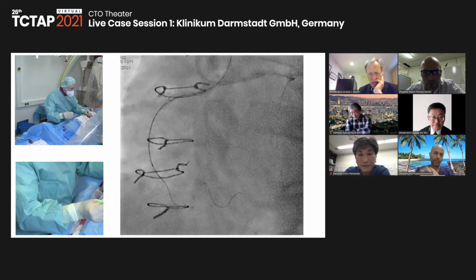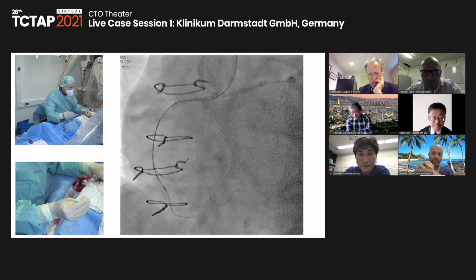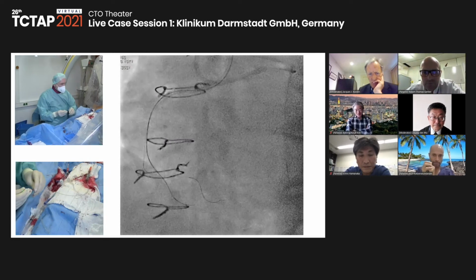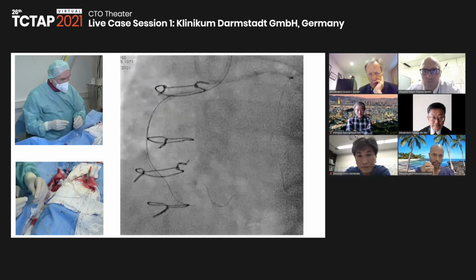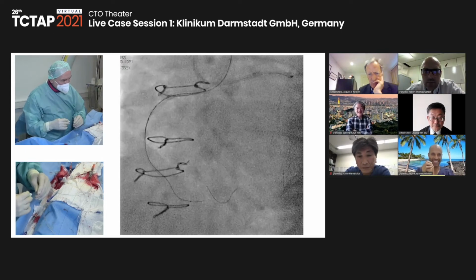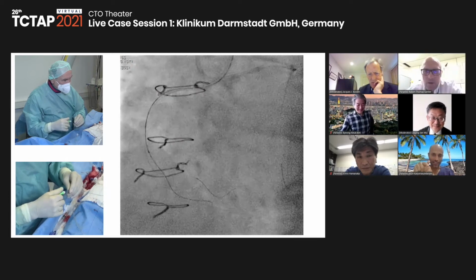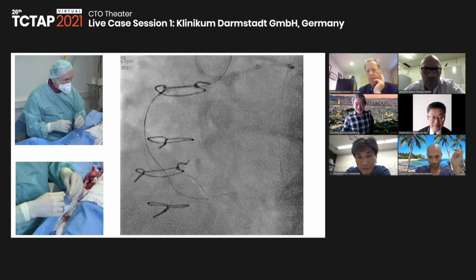So as you're working, Dr. Werner, I mean, first of all, very challenging case. You see the Fine Cross easily goes down. Yeah? You underestimate the Fine Cross, the good old Fine Cross, I can tell you. But this is too much movement, so I'm probably subintimal here.